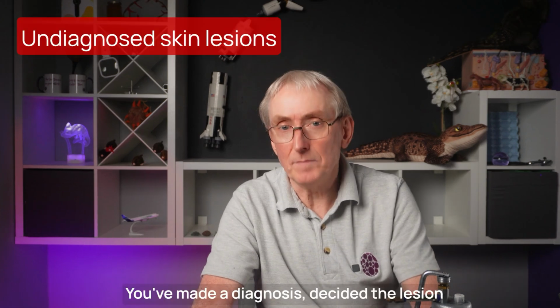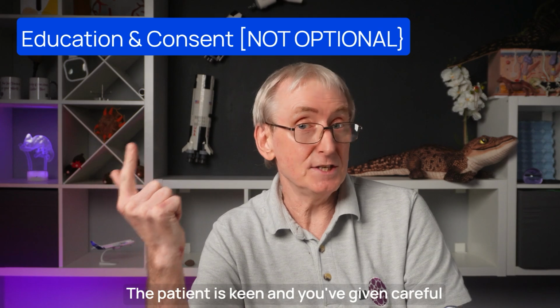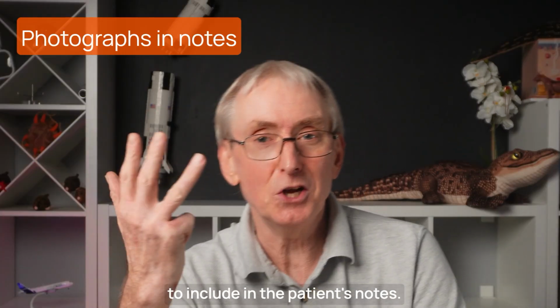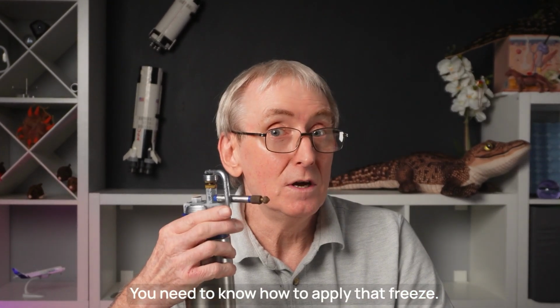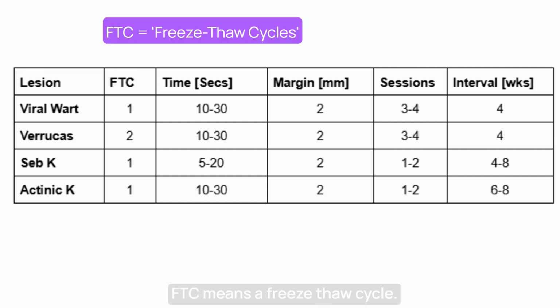Let's review. You've made a diagnosis, decided the lesion is one you can treat with cryotherapy. The patient is keen and you've given careful counselling. You've taken photographs to include in the patient's notes. What else do you need to know? It's time to do the fun easy bit. You need to know how to apply that freeze. Here's a chart with suggestions where to start for particular skin lesions. FTC means a freeze-thaw cycle.